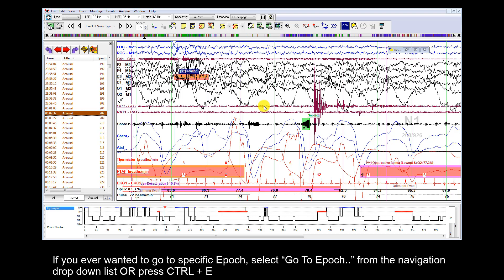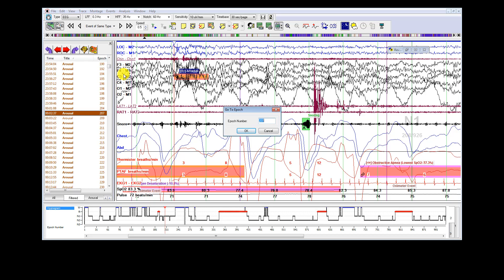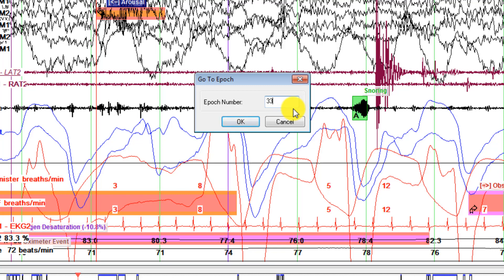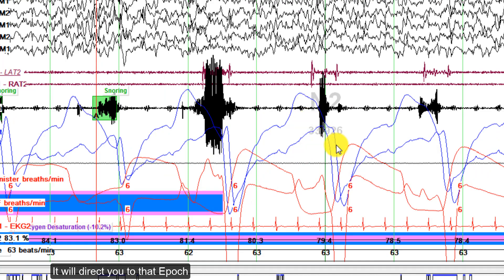If you ever want to go to a specific epoch, select Go To Epoch from the Navigation menu, or press Ctrl+E. You will see a dialog appear on the screen. Enter your desired number and press OK, and it will direct you to that epoch.